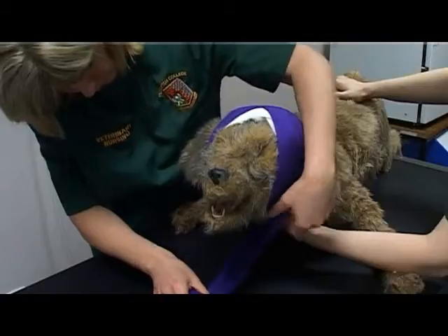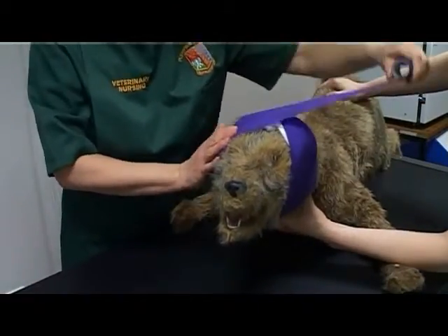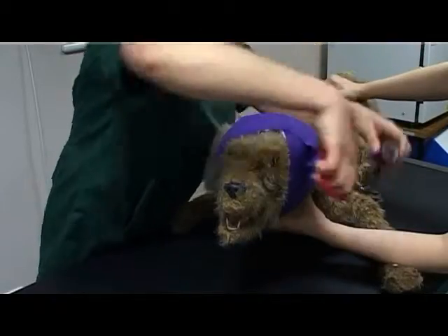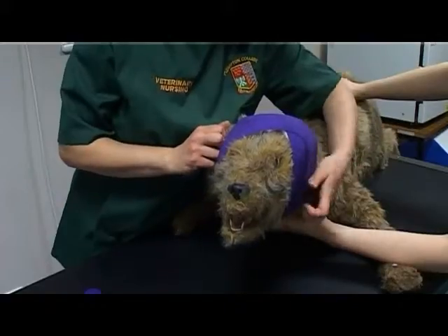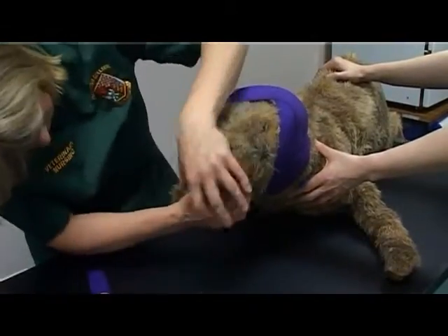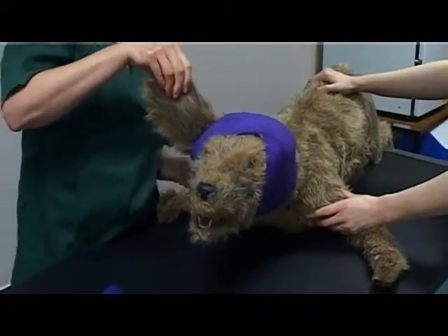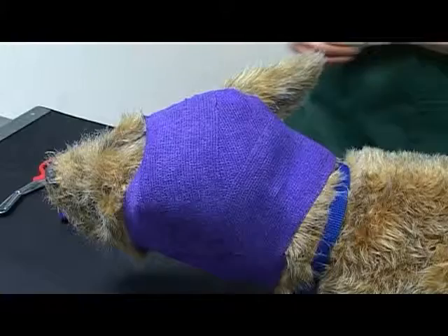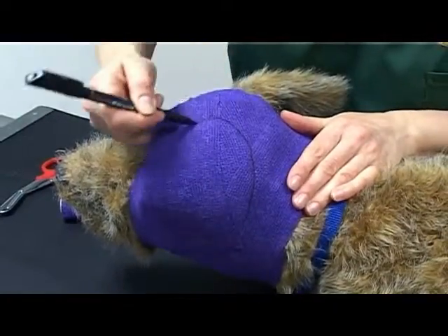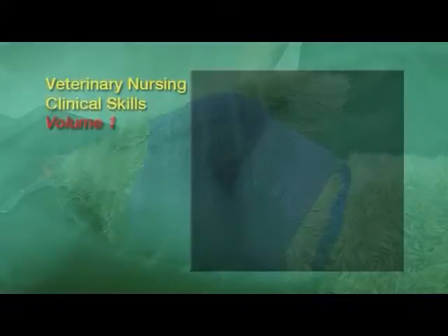Check the airway is not restricted. Check suitable tension of the bandage — this should be secure but allow the animal to function normally. Again, check the airway is not restricted. Check the bandage is neat with no exposed padding or underlying bandage showing. Mark the position of the ear using a marker pen.